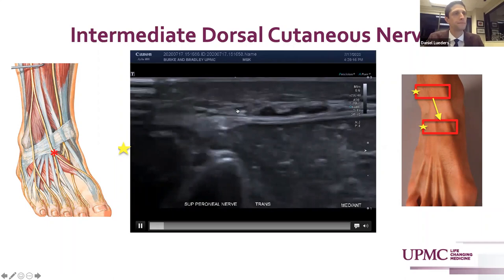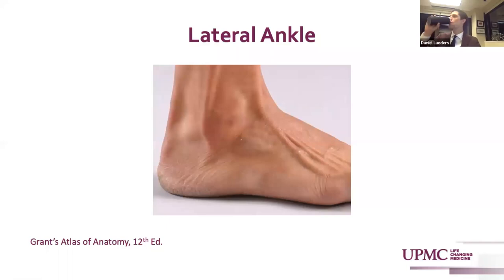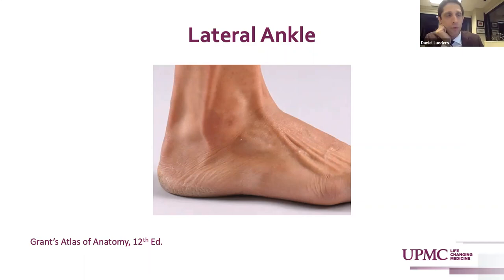Moving down to the lateral ankle. The lateral ankle can be evaluated with the patient in a lateral recumbent position on the opposite side so that the ankle of interest faces upward toward the ceiling. Its prominent structures are the fibularis or peroneus tendons — the longus and brevis — the anterior talofibular ligament, the calcaneofibular ligament, and the posterior talofibular ligament, which form the lateral ankle stabilizers, as well as evaluating the posterior subtalar joint and the sural nerve.